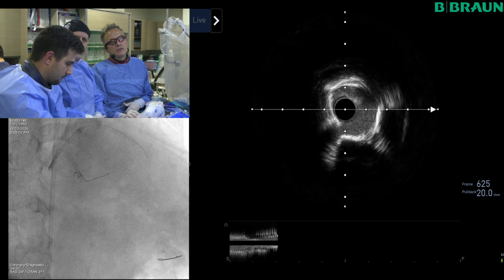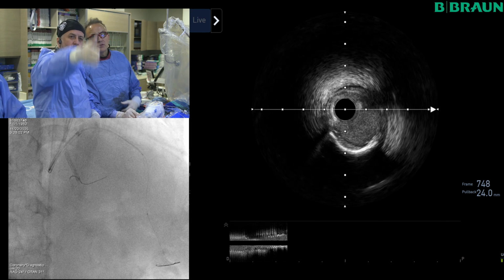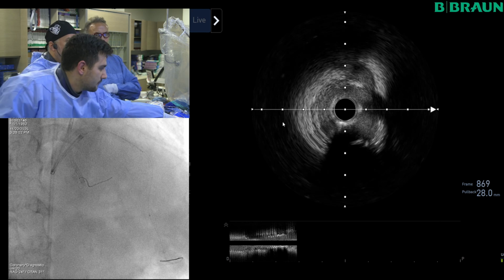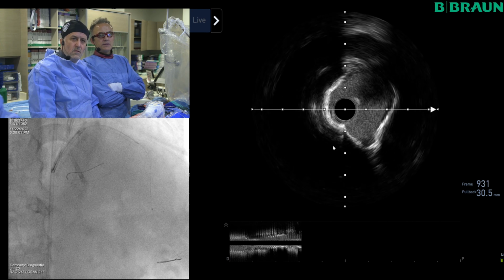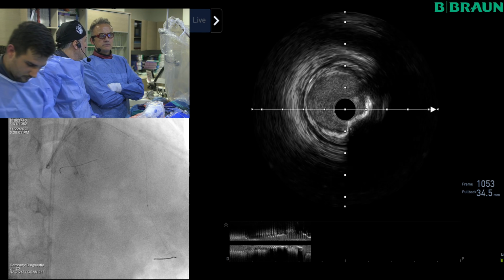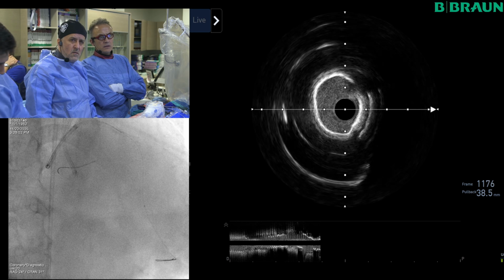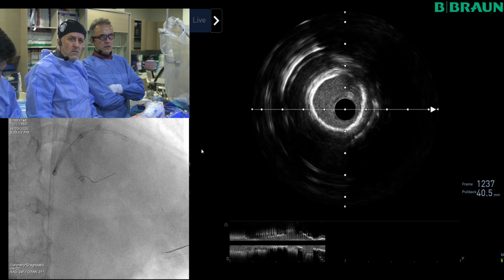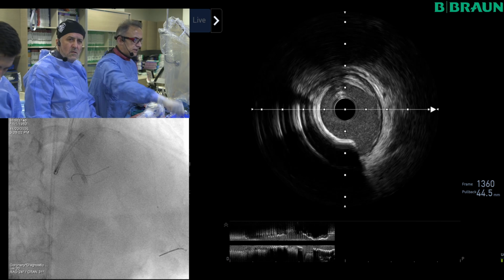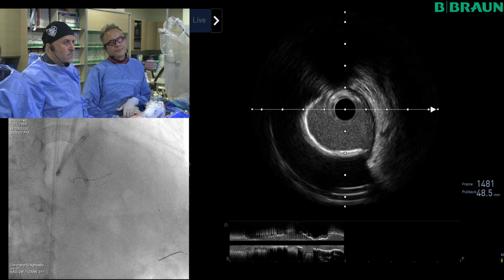Yeah. So the things that I'm seeing on this IVUS run as it's going by at the moment are, firstly, that the distal vessel is at least 2.75, maybe 3.0 in diameter. That we've created a lot of fractures in the calcium. There's our diagonal just coming in there, and we've got pretty good luminal gain, maybe a bit of change here approximately, but overall, we've modified that calcium and are now ready to think about what next.